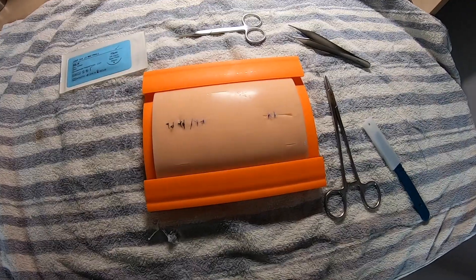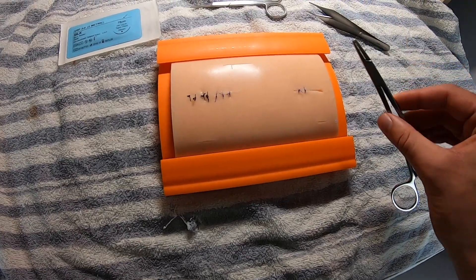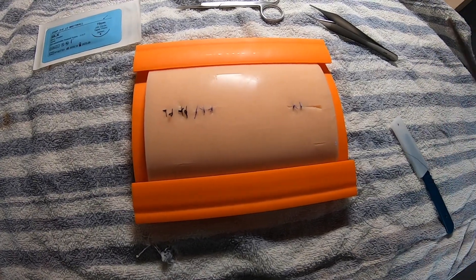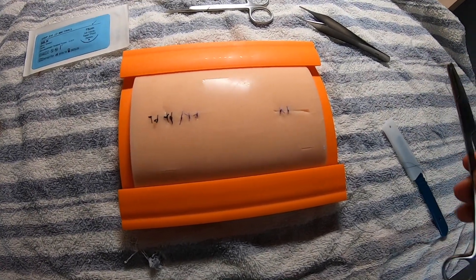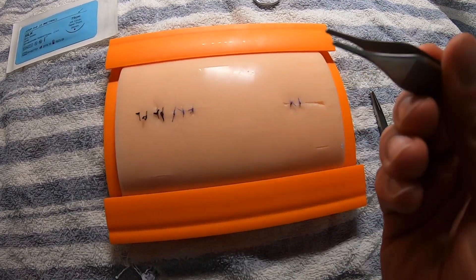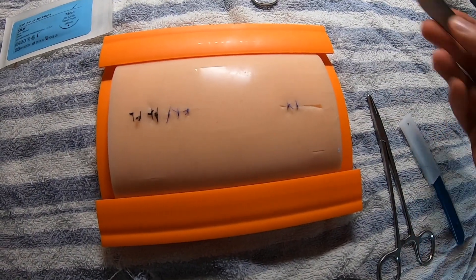Before we move on to the actual egg transplant, I'm going to show you what I've been using to practice suturing. I'm in first year of medical school and haven't had time to specifically work on suturing techniques, so everything I've learned is self-taught. This is the kit I've been using to practice. First we have our needle drivers complete with the actual suture inside — these are really important for driving the suture in, making your bites, and closing the wound. Then we have our forceps, which at the tip have little teeth to pull back on skin for skin suturing.